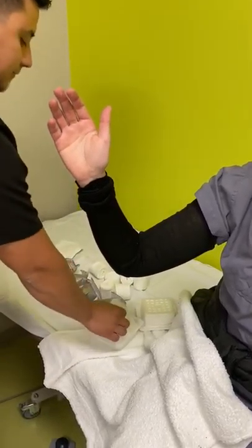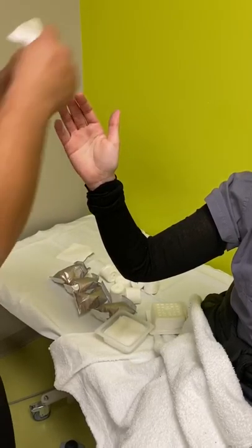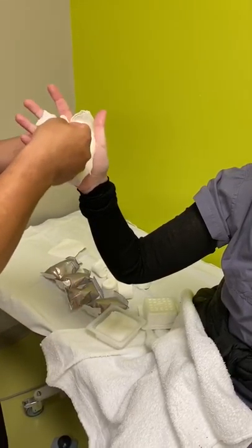Here is a demonstration of how to place a mitten cast. Ray has put on the stockinette over the arm.